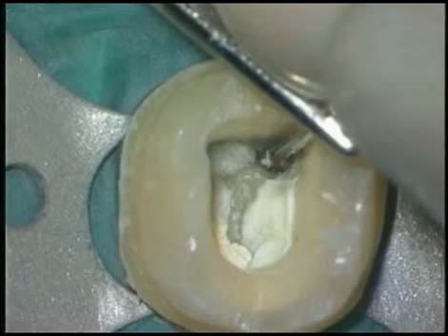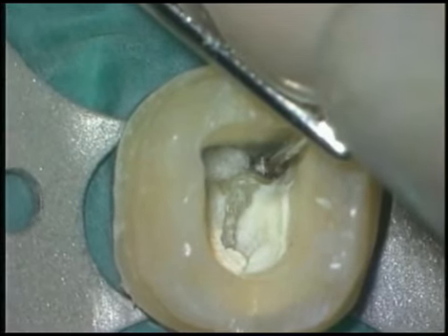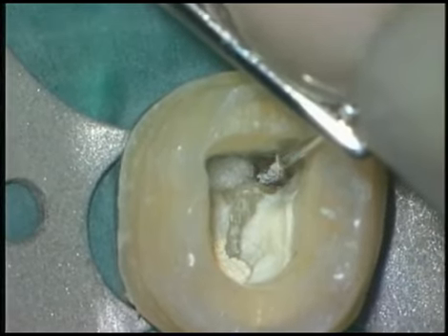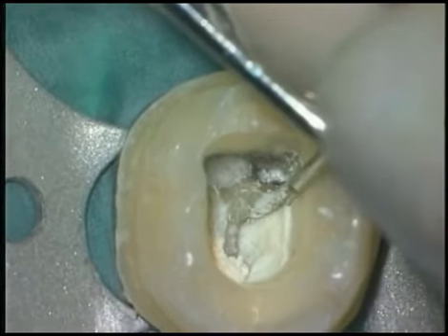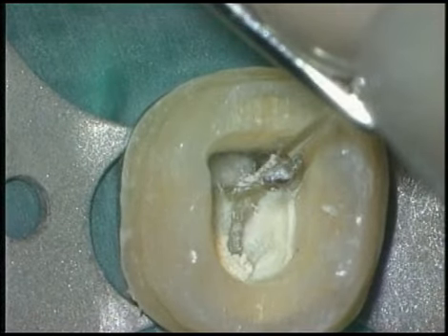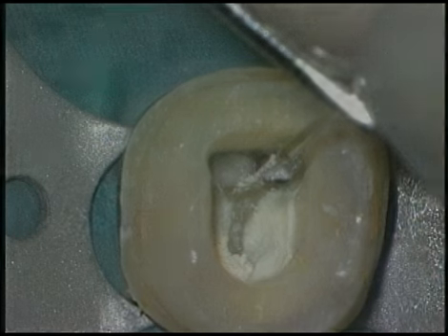When the apparatus is removed, it's pretty exciting to see that the broken instrument is retained. Notice its curvature, and notice all the debris on its cutting flutes. Clearly, this broken instrument was very securely bound in the root.